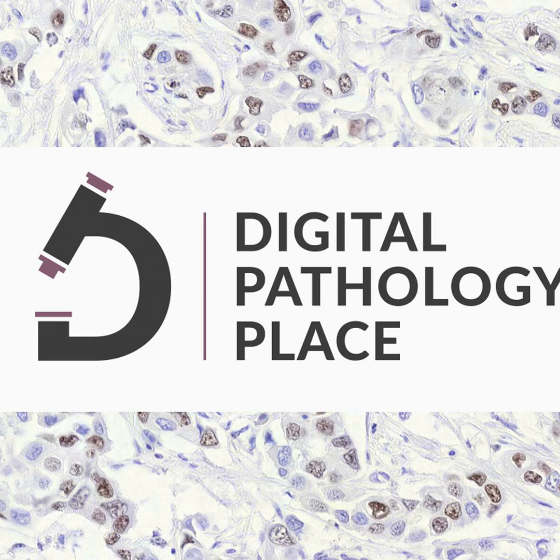They were frozen sections from explant kidneys obtained for organ donation. These were evaluated, and a board-certified renal pathologist established ground truth through manual digital evaluation on the TechSite Fusion platform. So there's another thing that I liked in this paper, other than that I know the people and that I just talked to them at the conference, and they have a pretty good product. I'm going to tell you about it in a second.